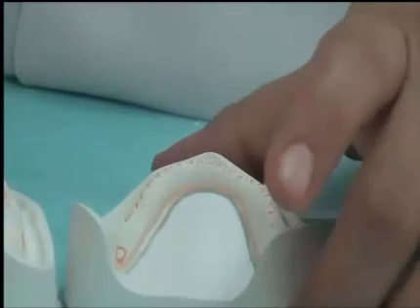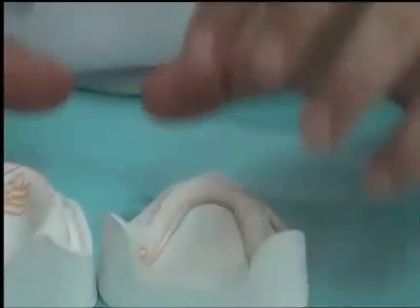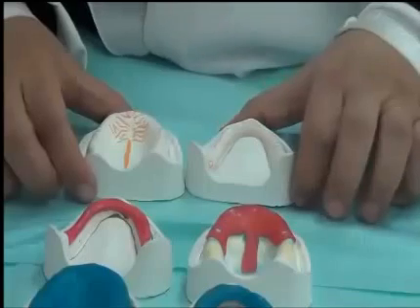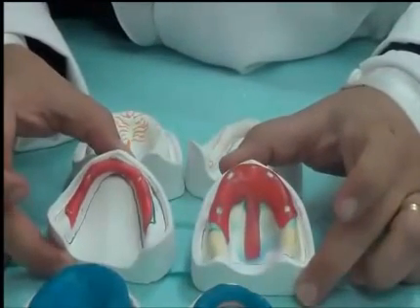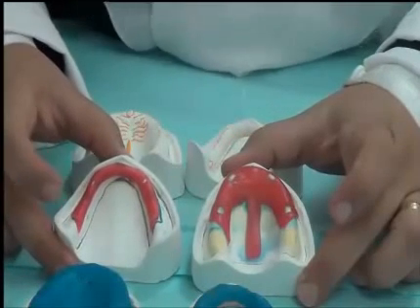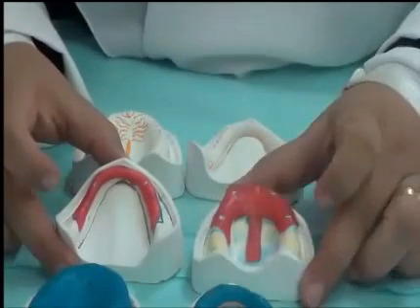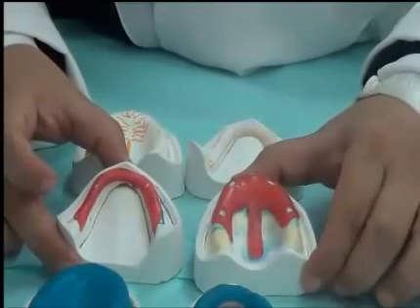Now, for us to make the tray not press too much on the tissue while taking the impression, and this is called selective pressure technique, we can do more than one procedure. We can either select the areas where we pressurize and the areas that we want the impression to be static by placing the wax beneath the tray. So if I make a tray material, hard tray material over this wax, in the areas where we have wax, the tray will not come in close contact with tissue.